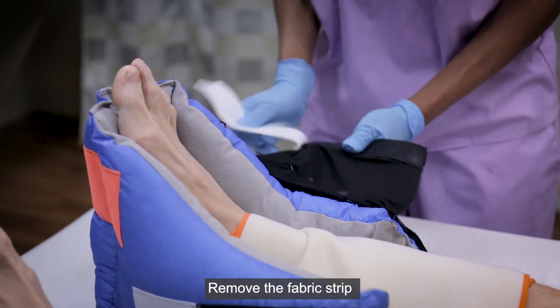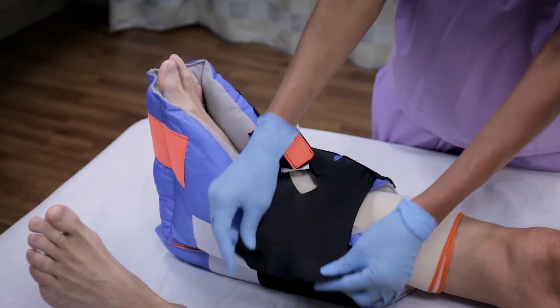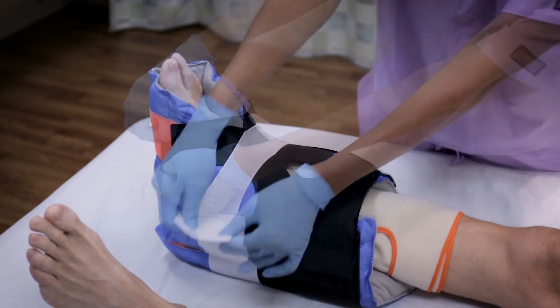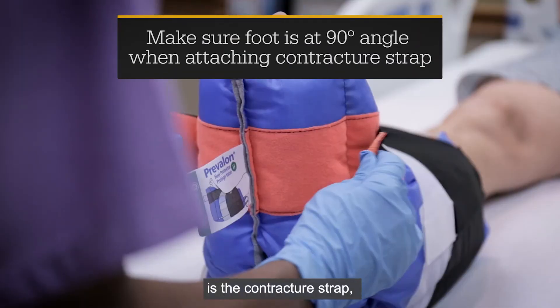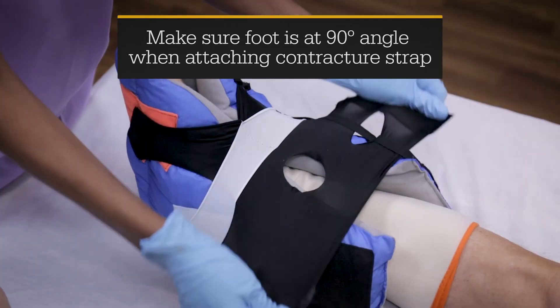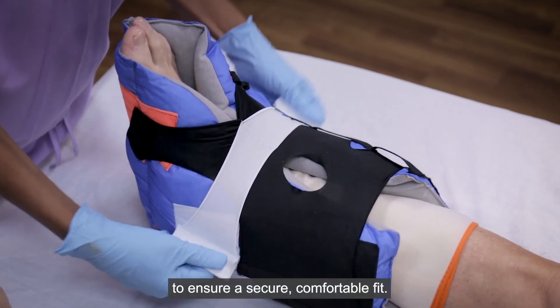Remove the fabric strip covering the stretch panels. Attach the stretch panels to the color-coordinated landing pads. The orange stretch panel is the contracture strap, which helps keep the foot in an upright position. Adjust the stretch panels to ensure a secure, comfortable fit.